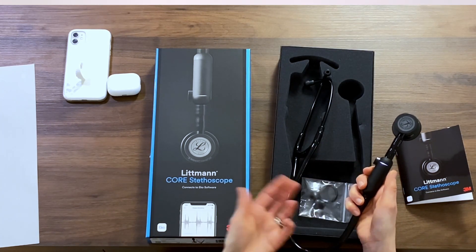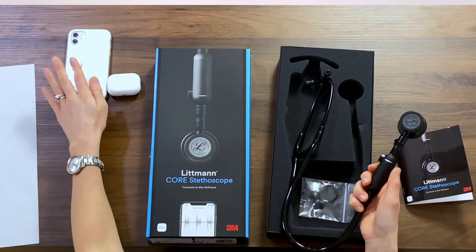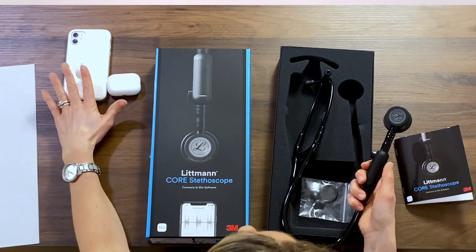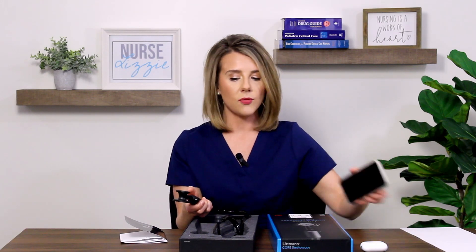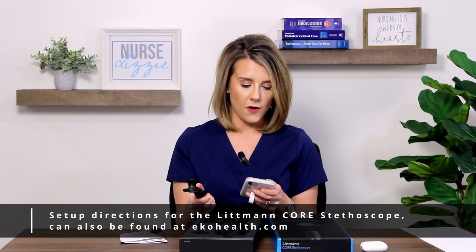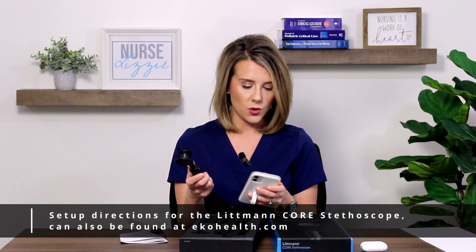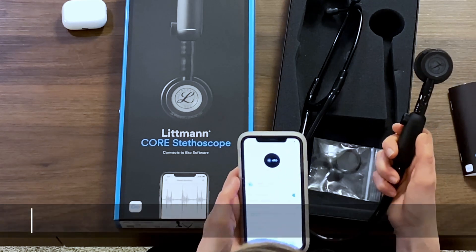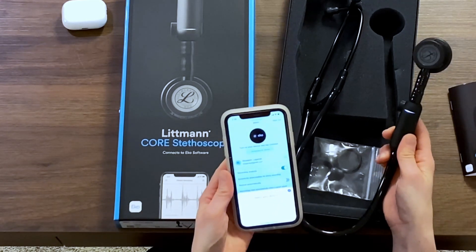Once you have the battery fully charged, you can go ahead and grab your smartphone. I already have the Eko app downloaded to my phone from previously looking at the product. I can go ahead and pair this stethoscope with the app on my phone and it will detect once the stethoscope is turned on. Super easy to pair the device.